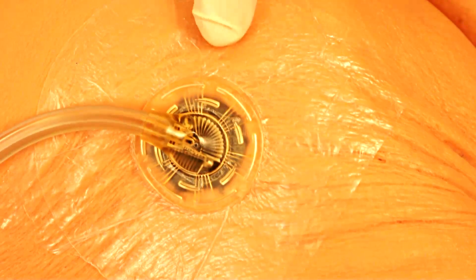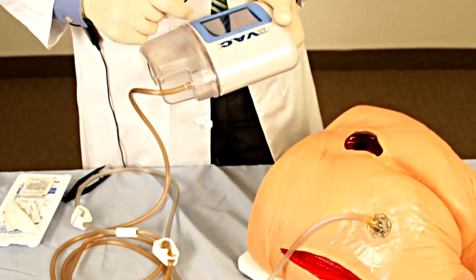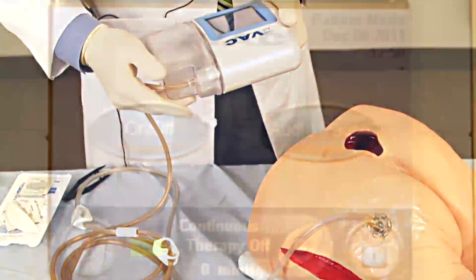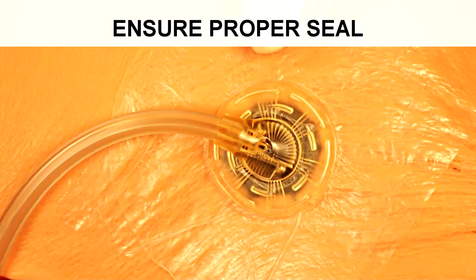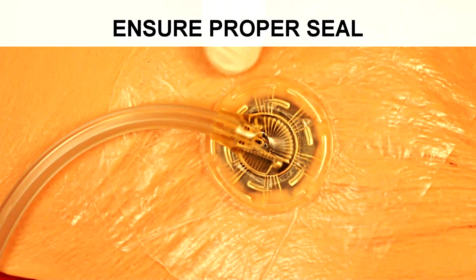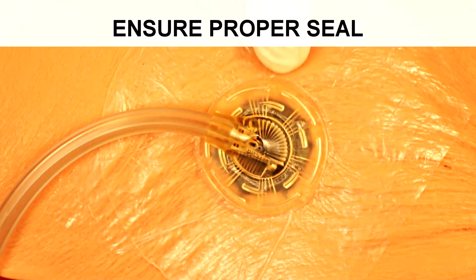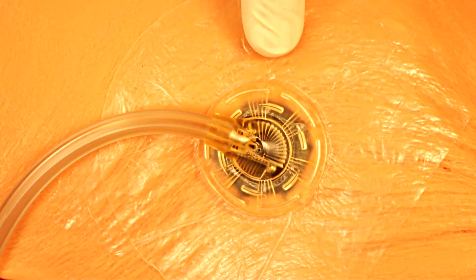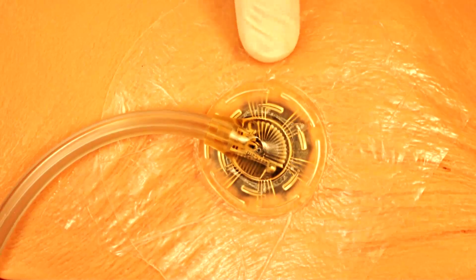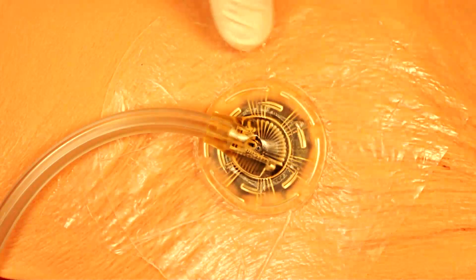The generators are designed so that there are a variety of audible alarms. Most commonly, an alarm will generate if the collection canister is full or if, in application of the dressing, the seal that allows the continuous negative pressure suction to be generated directed at the wound bed is broken. If the seal is broken, you may hear an audible alarm from your generating device. If this occurs, one would need to examine the dressing application.